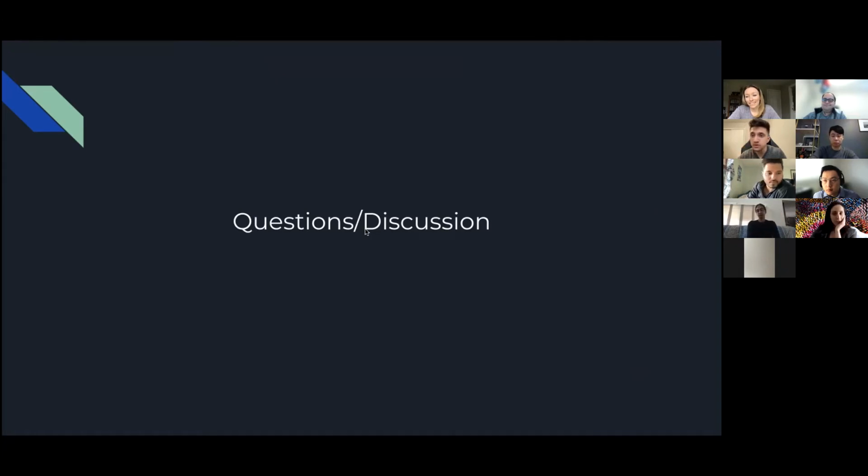I just had a quick question, sorry. This is Monty, I'm from U of T. We're just starting in the early stages of our POCUS program, so VExUS is really a bit further out from where we are. Is there literature to show that use of VExUS will reduce ICU transfers from internal medicine, or reduce time to improving renal function in your diuresis patients?